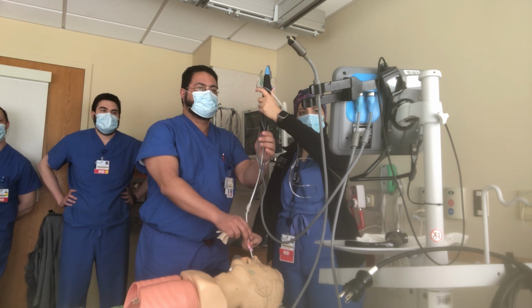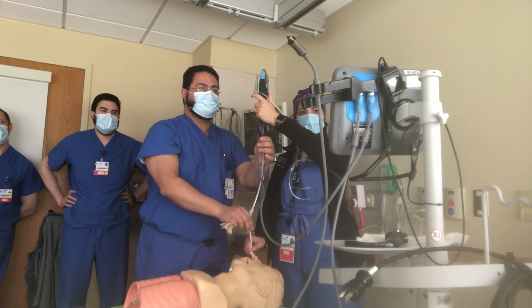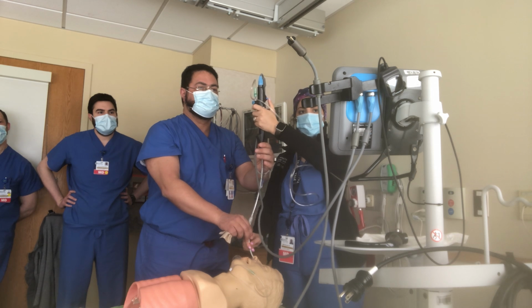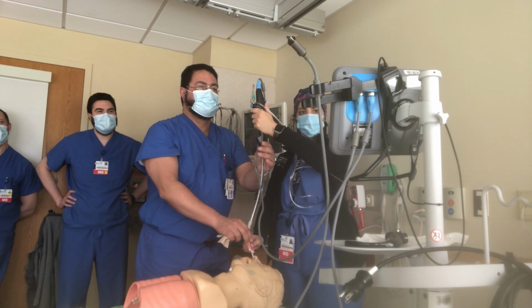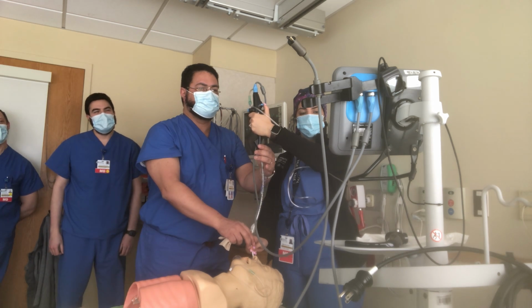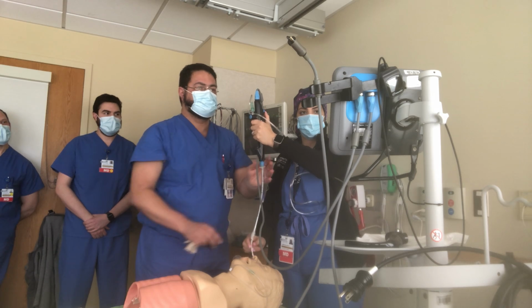They did recommend flex by bringing this down. Oh, you found it, yeah, right. And then retroflex. Alright, now flex, perfect. No, retroflex now, no, the other way. Yeah, push, yeah, you're right.